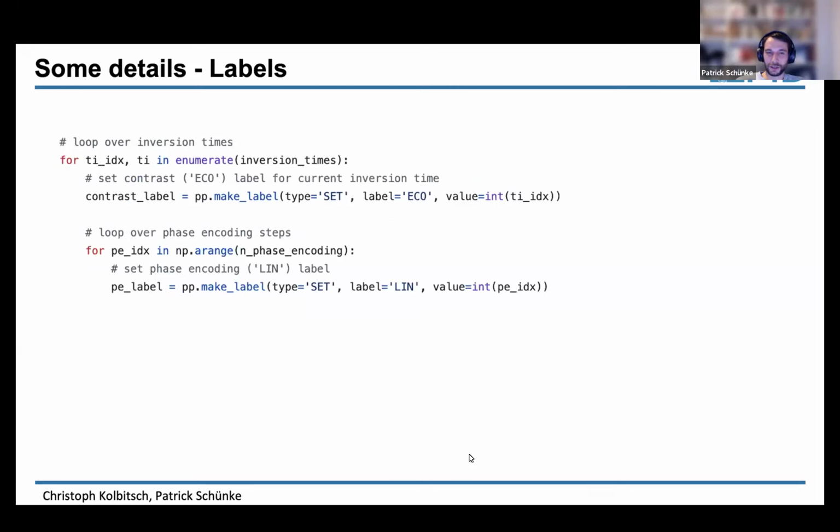It's fantastic to see what is actually possible if you use the correct labels in the correct way, with ramp sampling and oversampling and partial Fourier reconstructions working in the ICE framework directly at the scanner. So I can highly recommend it, and for our reconstruction framework, it's not mandatory. We can still do it retrospectively, but we also make use of all these labels that are set in the MRD file, and it definitely simplifies your post processing.